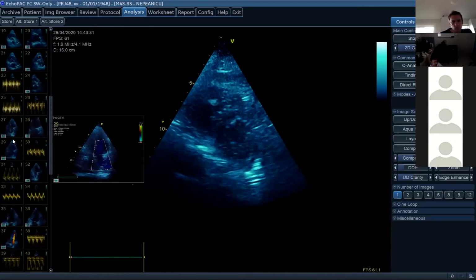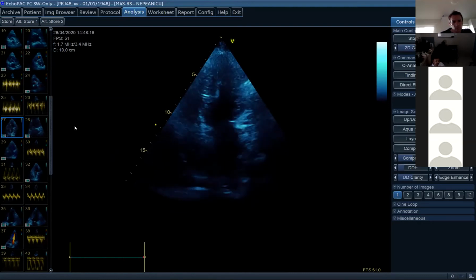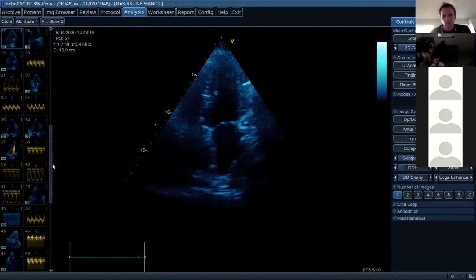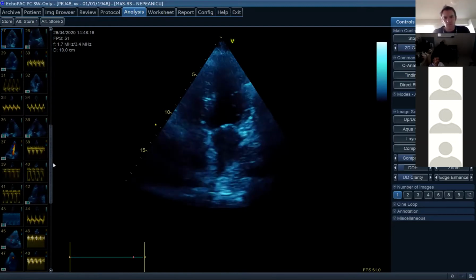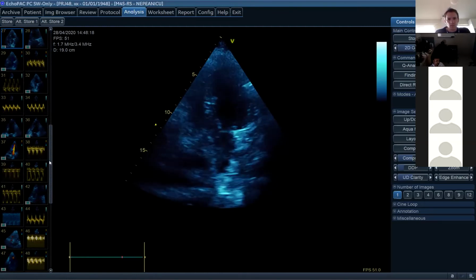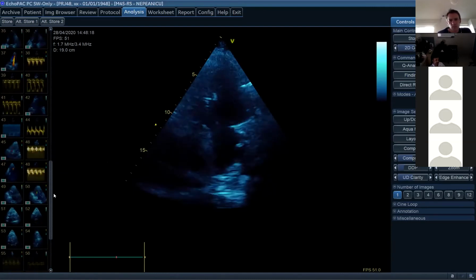And then I'll show you the apical 4 that you were after. Does that come through okay? Can you see that you've got that kissing ventricle sign as well? Yes. Anything else that we might be able to look for? Then maybe get a subcostal view and look at what the IVC is doing. Yeah. And then VTI, yeah.